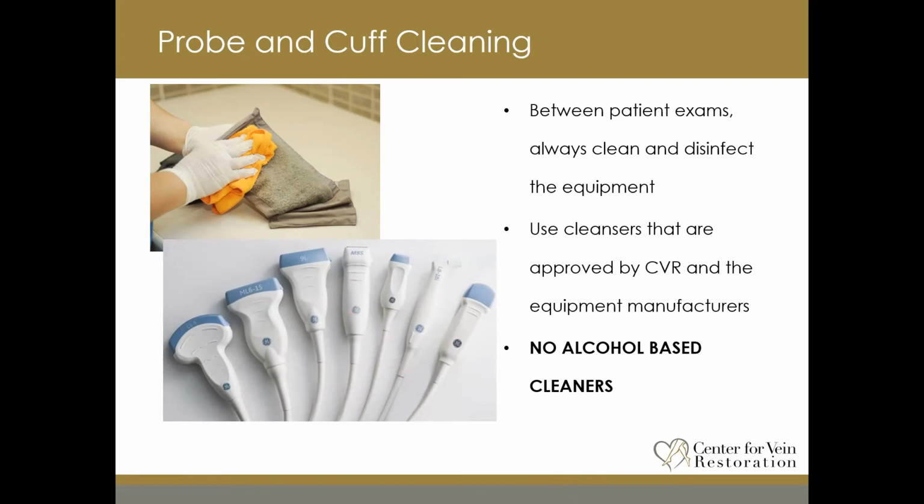hits something hard. If that probe falls to the ground and hits the ground, it can break the crystals that are inside this probe. And if that happens, you can put as much gel as you want on that ultrasound probe. You will have blackout in your images. Wherever that crystal cracked, in that space, there will be a dropout in your image, so you'll see nothing. So I know this was to discuss cleaning, but I wanted to add that in, to be mindful of management of that probe so that it's not getting hit up against anything or dropped.